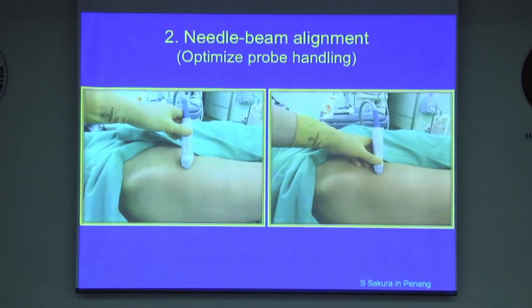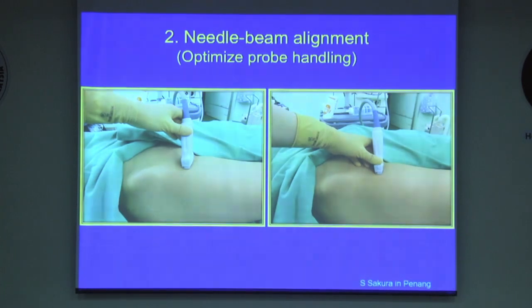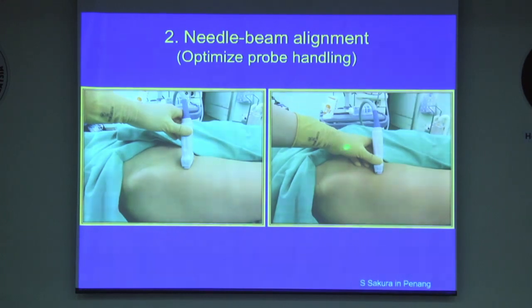The key to good needle imaging is the ability to make small movements of the probe, and in order to achieve this you must control the probe precisely. This is best achieved by stabilizing the probe. The outer aspect of the probe hand should rest on the skin of the patient.